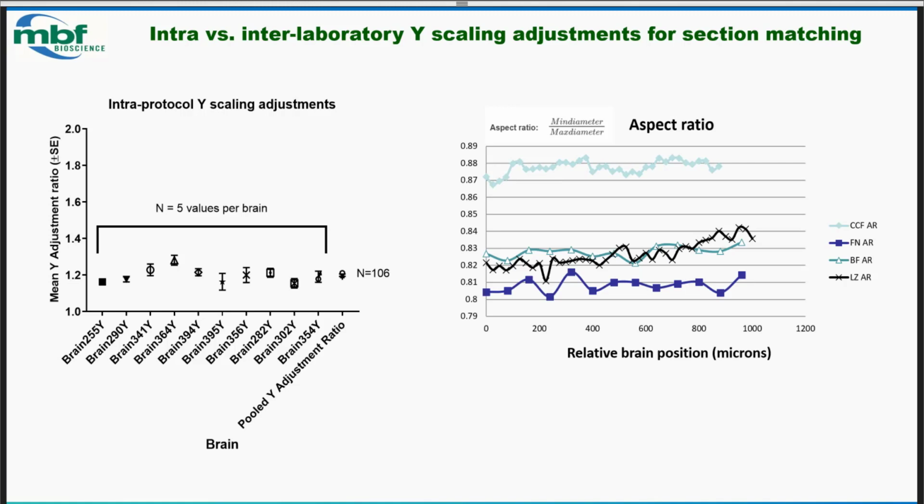Not surprisingly, if you go to other laboratories with slightly different protocols, you get different correction factors, but we're finding that they're all pretty consistent within a laboratory. So that was an impactful thing, and really impacted the direction that NeuroInfo moved forward in: you can start with the scaling factor for every brain you work with.